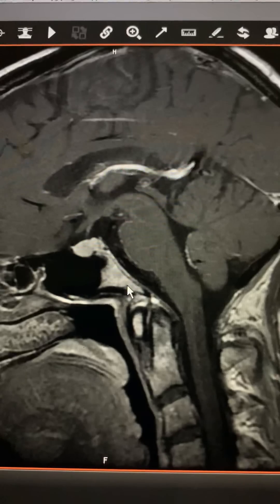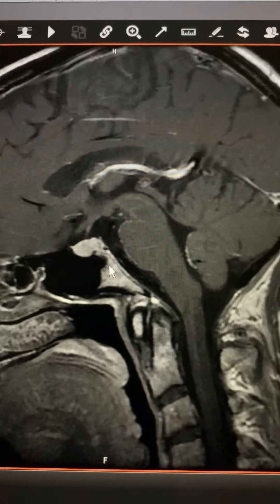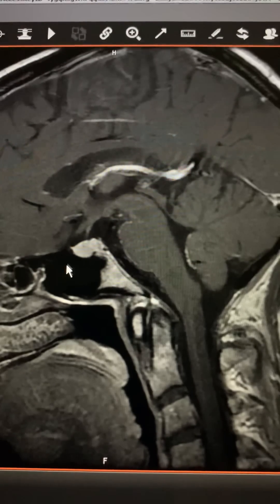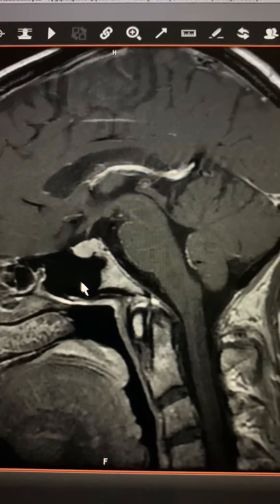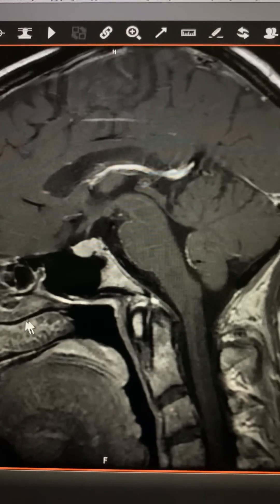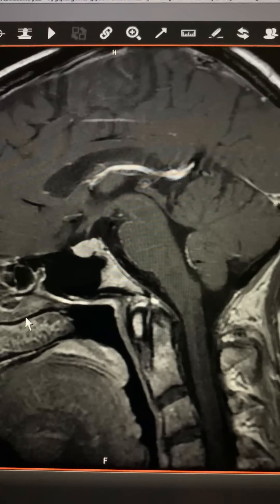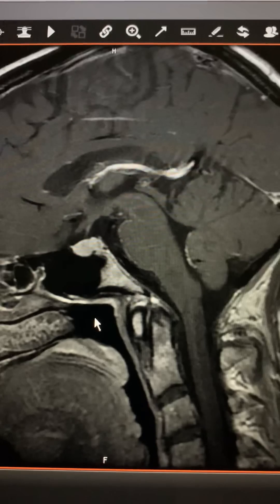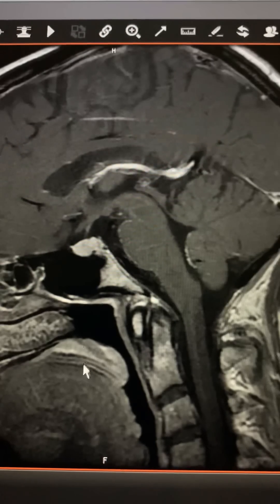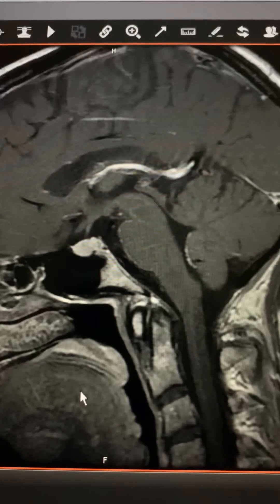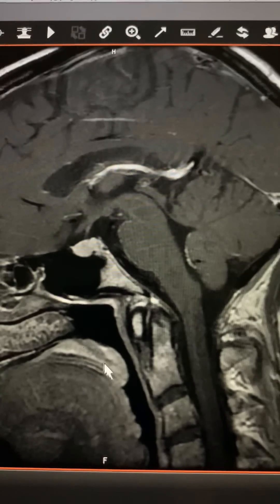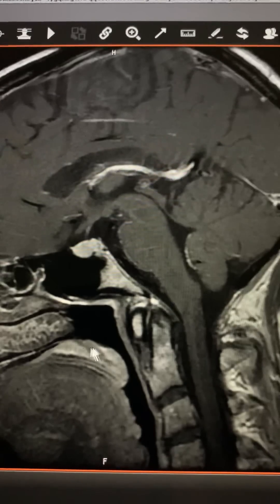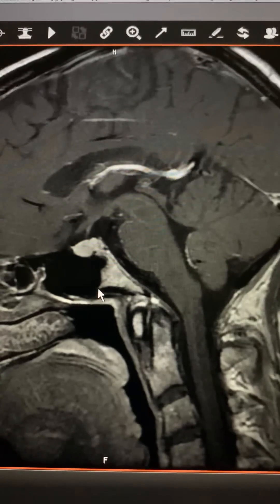This is the clivus — it's the base of what's called the sphenoid bone. And here is your sphenoid sinus, the inner contents of the nose, the back of the throat, and the tongue. This would be the soft palate — so this is the back of the throat, and that's technically the back of the nose.